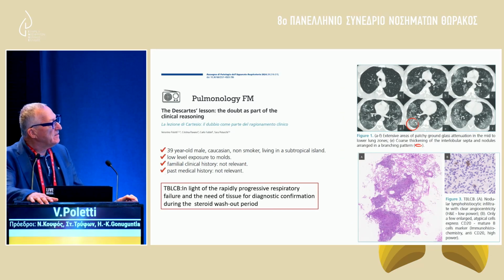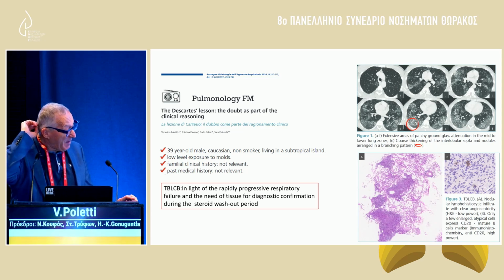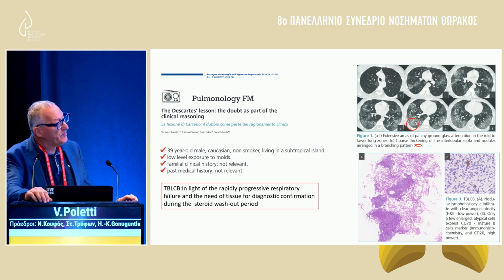Another case, a rapidly progressive patient with ground glass attenuation and nodules. He had a previous hypothesis of lipoid pneumonia, but the diagnosis was lymphoproliferative process.